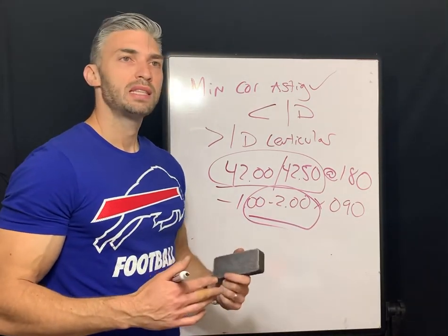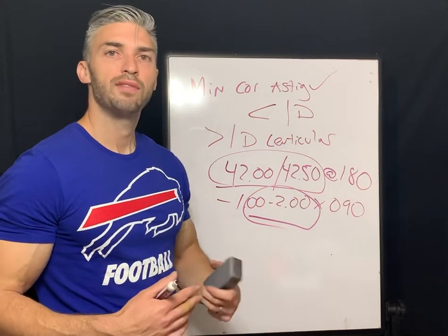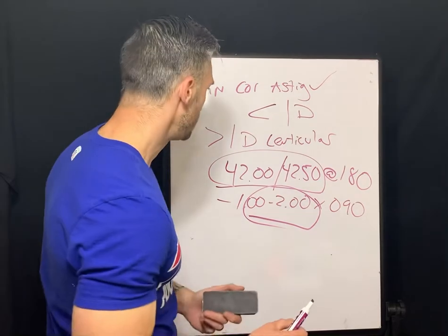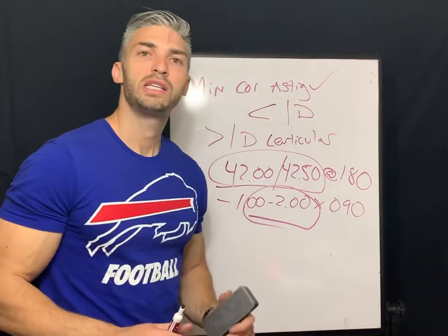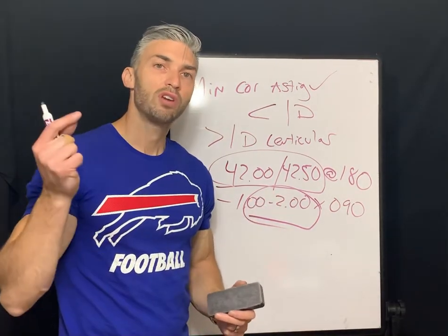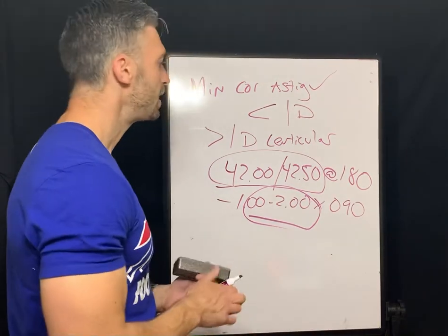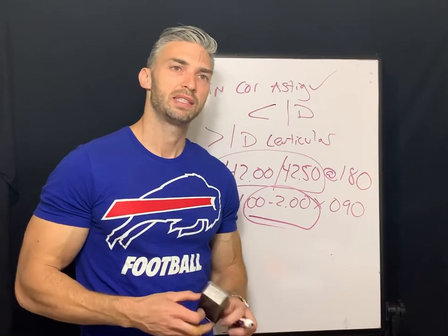So we would say that this patient is a candidate for a front toric rigid gas permeable contact lens. That's your clue that you're going to see on the test to make you think front toric. Oh, it's not corneal astigmatism. So not too bad. I think a lot of times we overcomplicate these things.